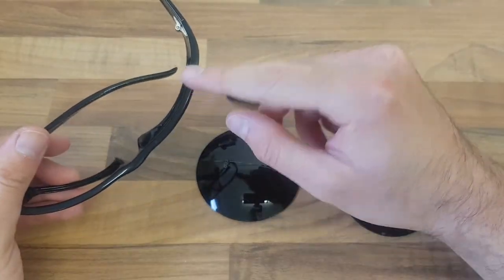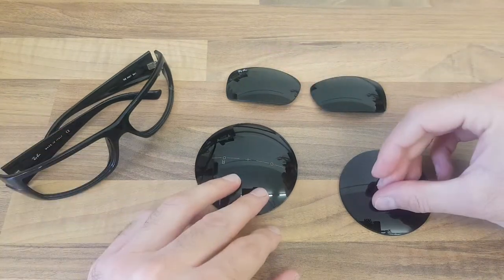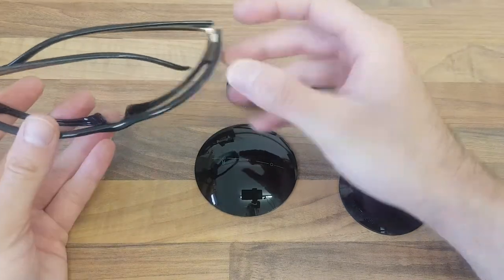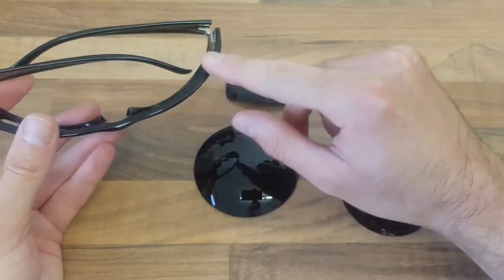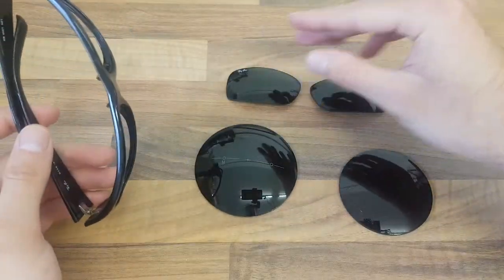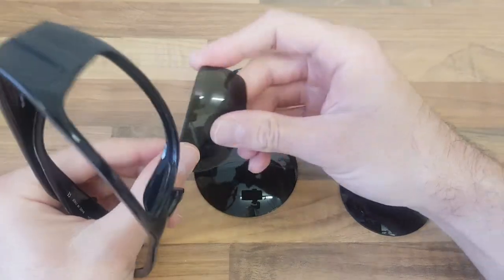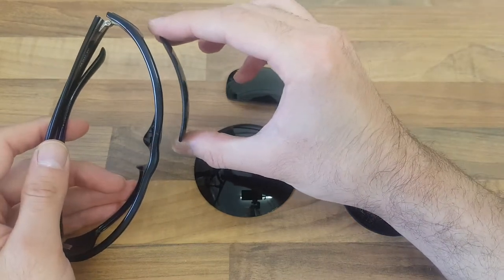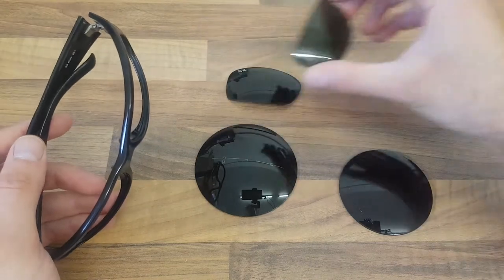A lot of it has to do with how your prescription lens is suited for the curvature of a frame. A lot of frames like this will have what we call a high base curve or a high wrap — that refers to the curvature of the front of the frame. The lenses that came out of this frame are the factory ones from Ray-Ban, made out of glass, and the curvature of this lens matches the curvature of the frame very nicely.